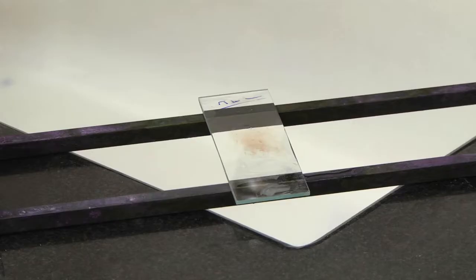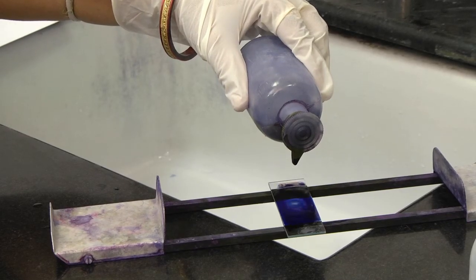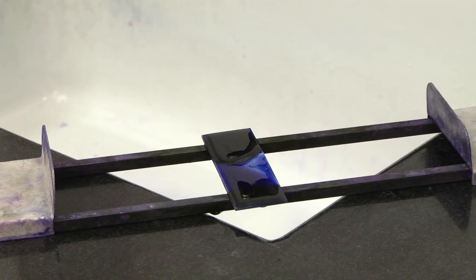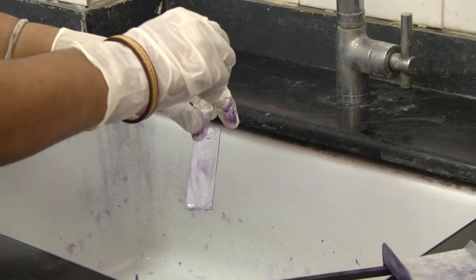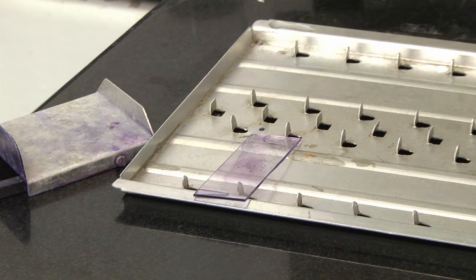After the smear dries, label the slide on the thick edge of the smear with another glass slide or a diamond marking pencil. This is done as the earlier markings can be washed away while staining. Add 7 to 8 drops of Giemsa stain. Let the stain stay on the slide for 20 to 30 minutes. Rinse gently for 3 minutes in buffered water. Drain, dry and examine.